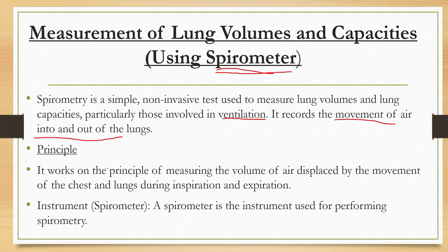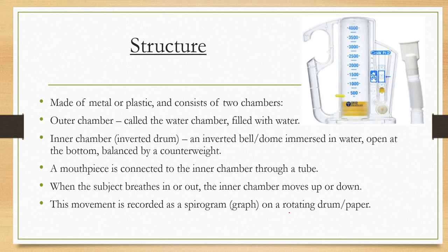Principle. It works on the principle of measuring the volume of air displaced by the movement of the chest and lung during inspiration and expiration. Instrument: spirometer. A spirometer is an instrument used for performing spirometry. Here is the structure of the spirometer.